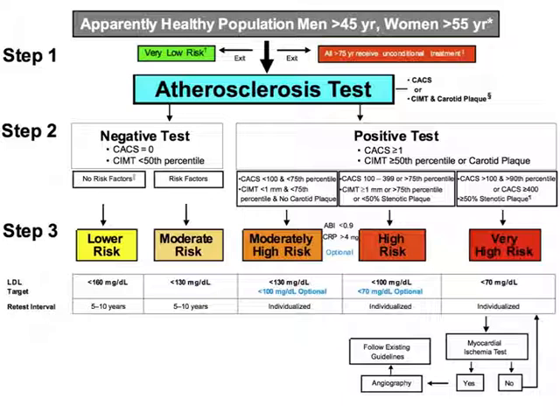Now, historically, it's been difficult to get serial CIMT measurements because it's hard to do logistically. Patients get lost to follow-up, they don't keep their appointments. You have to get these people in to see a sonographer on a regular basis, and sonographers are expensive. And so that's why CIMT, while it has some good data behind it, hasn't really taken off the way people thought it would, because logistically it's been difficult to do.